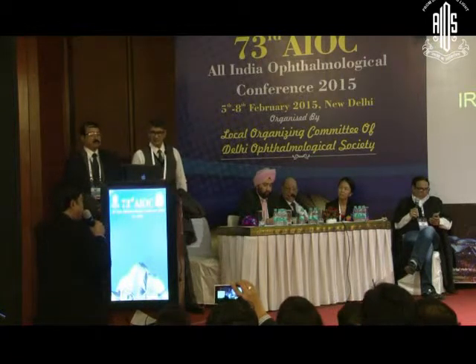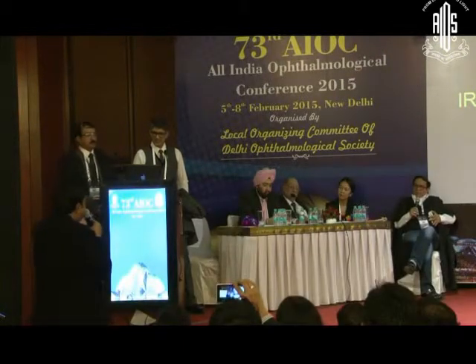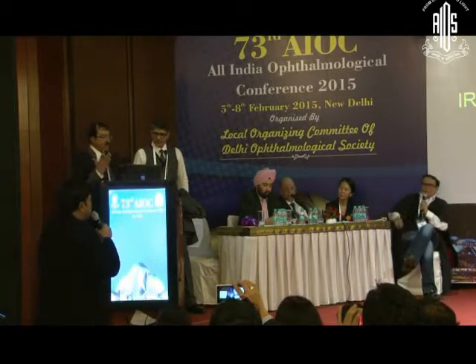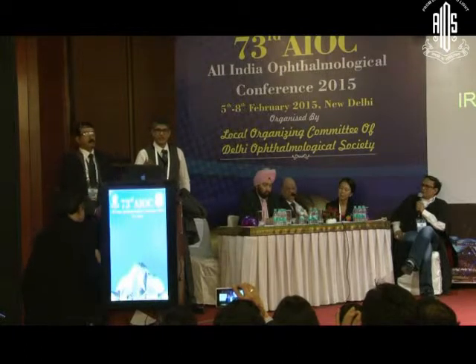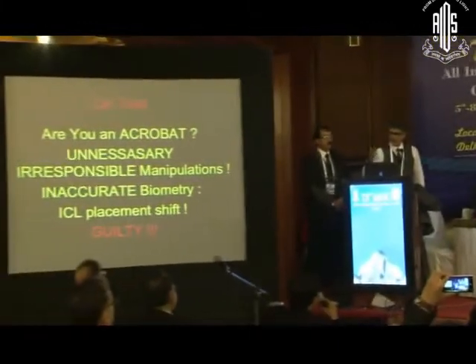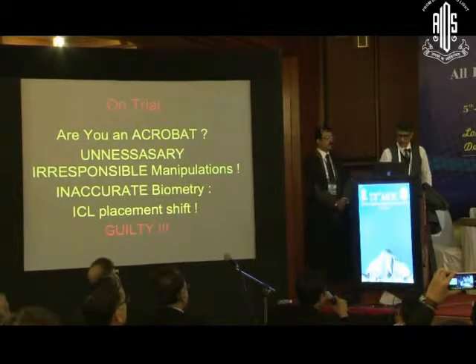And my public prosecutor is talking about the biometry. I think we are still evolving, and as he has said, he has put in a standard IOL power. Maybe this is a learning phase where you could come up with a newer method. Answer my question on the biometry. Yes, please. The biometry gave 47 diopters, but even with a good formula like the Haigis for short eyes, you cannot hit the nail on the head. Yes, absolutely. And never.